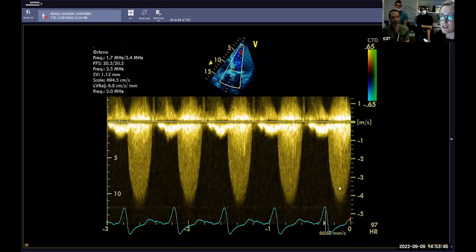But it did make me look for other things that could be elevating the gradient. So what other things might you look for that we might not have seen, because it's difficult imaging, that could be increasing her gradients? What else would she have? Higher gradients, so flow across the valve. She's got another reason to have elevated flows across the valve. Exactly right. So thinking about, is there aortic regurg that we've missed, or is there a septal defect or something, a hyperdynamic state increasing her flow.